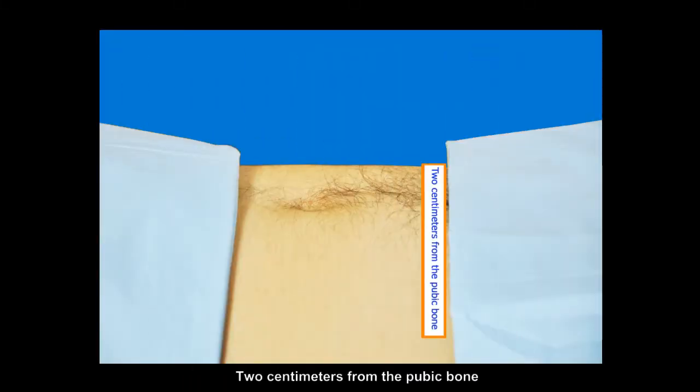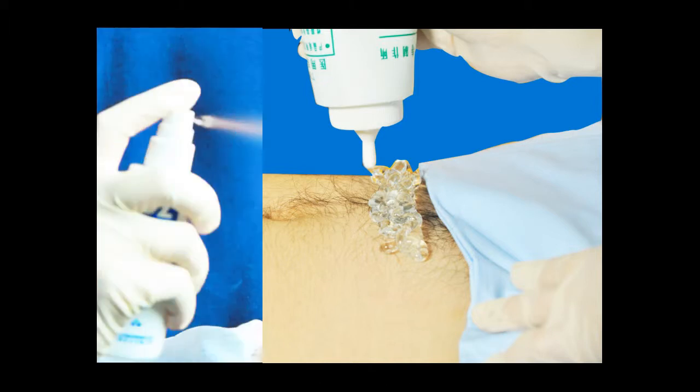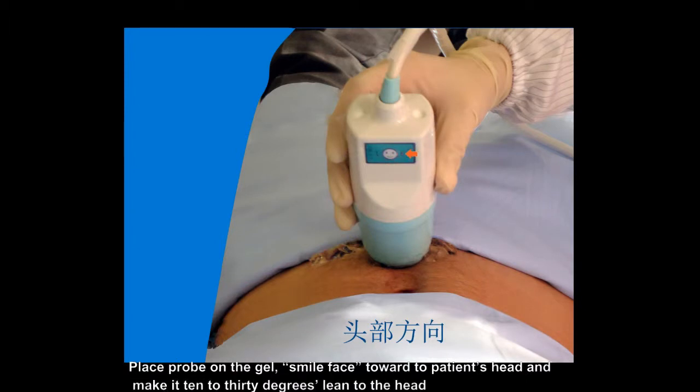2 cm from the pubic bone. Place enough gel onto it. Disinfect the probe. Place the probe on the gel, smile face toward the patient's head, and make it lean 10 to 30 degrees to the head.